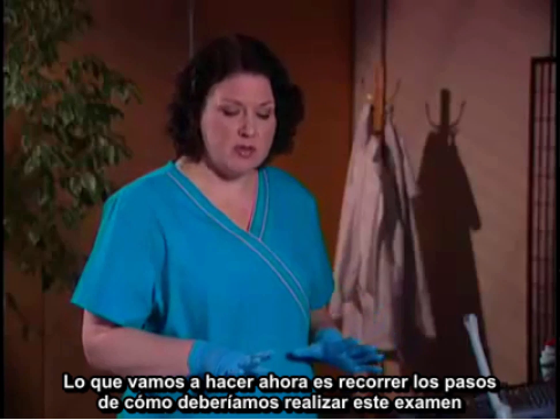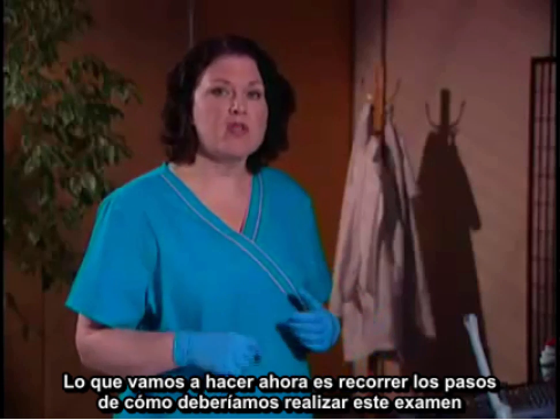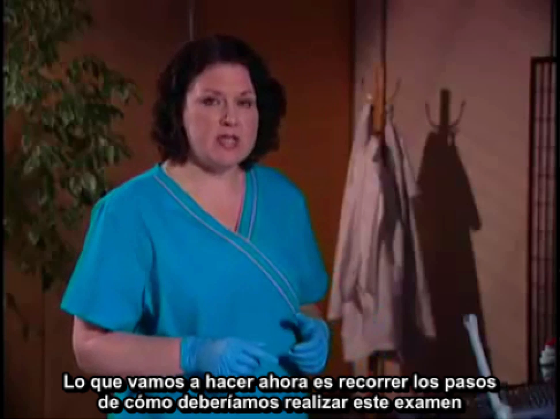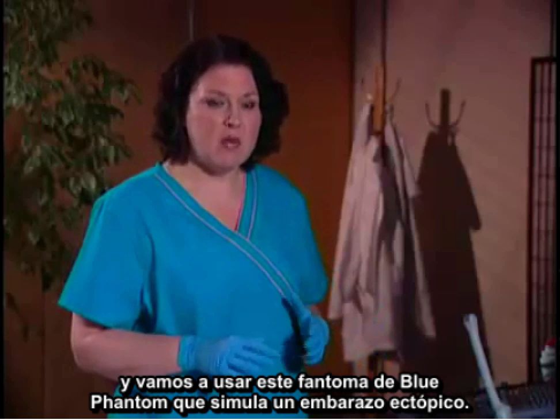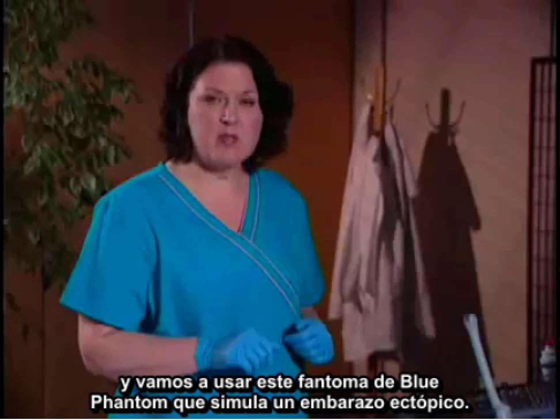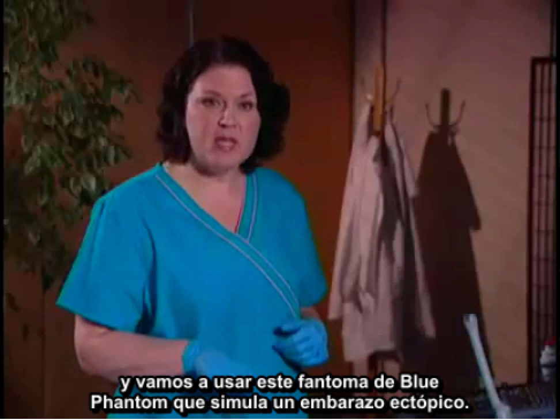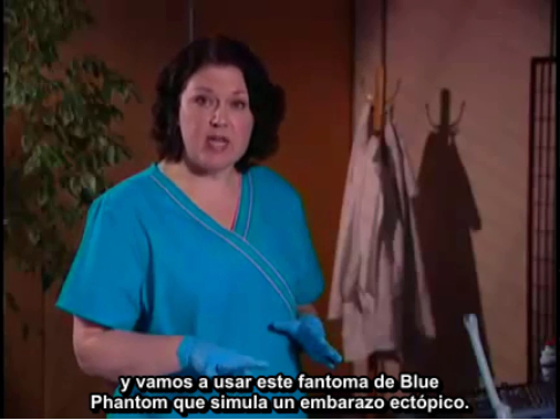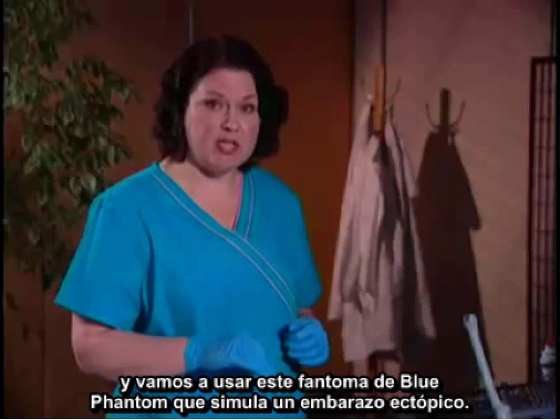What I'm going to do right now is walk through the steps on how you would do that examination. We're going to use this phantom by Blue Phantom that will actually demonstrate an ectopic pregnancy.